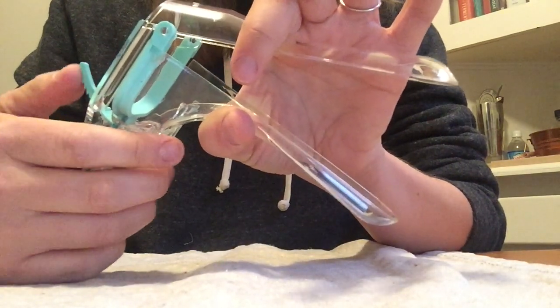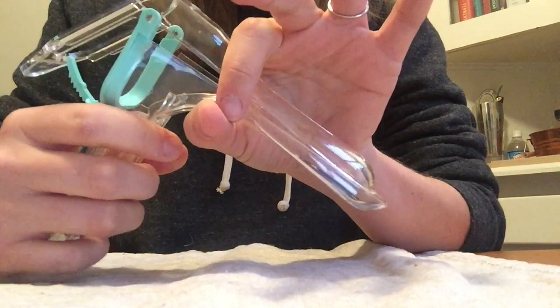After your care provider takes a look, they'll close the speculum and take it out.